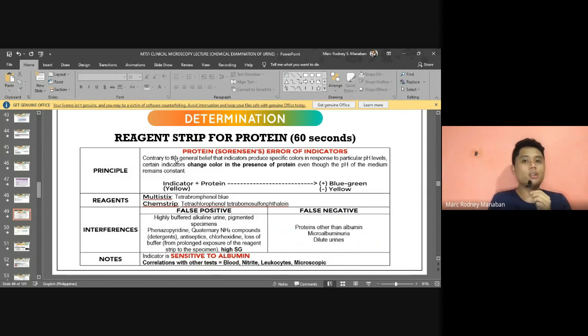Remember, with dilute urine the water concentration is high, so the expected result is negative, or almost nothing detected. But the fact that you detected a trace, even a small amount, indicates that the pathology in your body is intense. Even with high fluid consumption, protein is still detected, meaning a lot of protein may be excreted, which could only mean intense damage to the glomerulus or the kidneys.